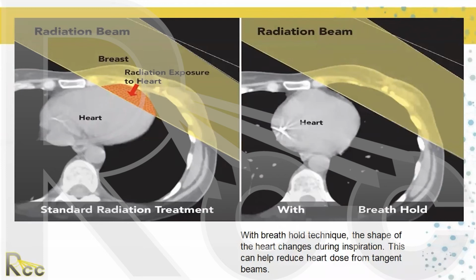But most of the early studies that were done with IMRT were actually focused on head and neck patients that did much better with IMRT than with conventional 3D therapy.